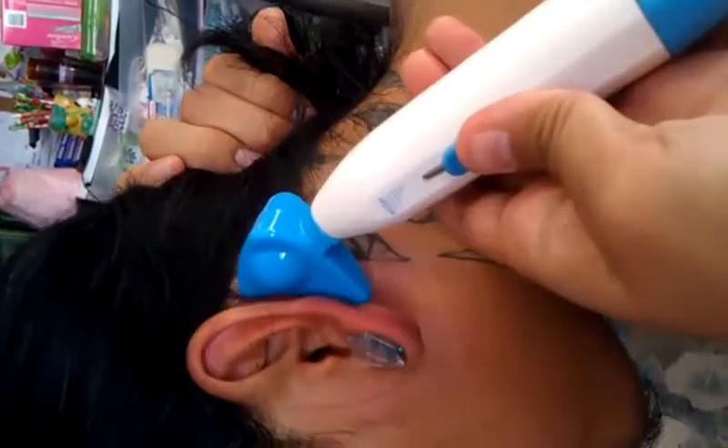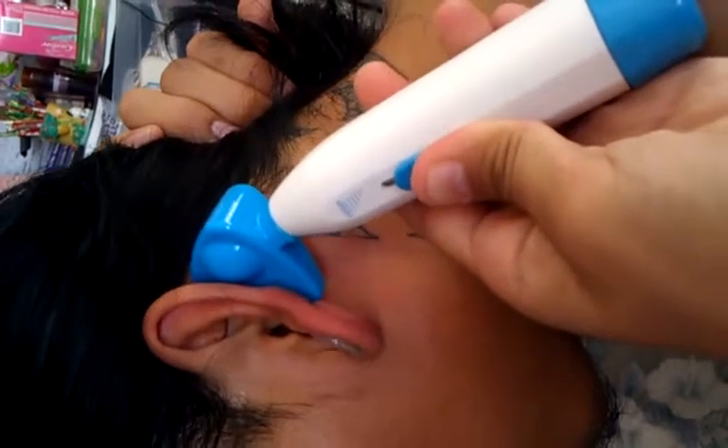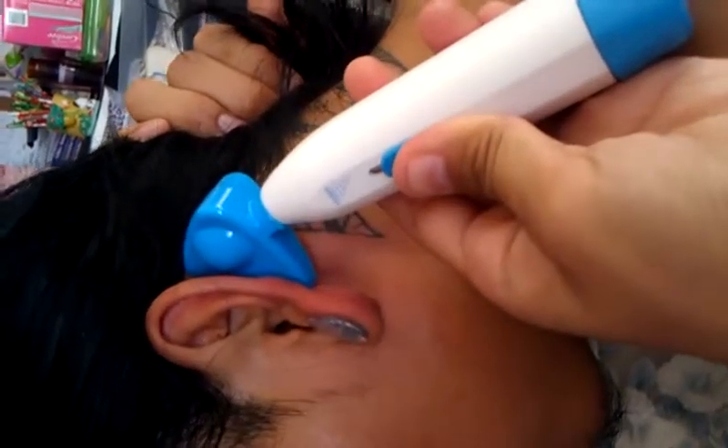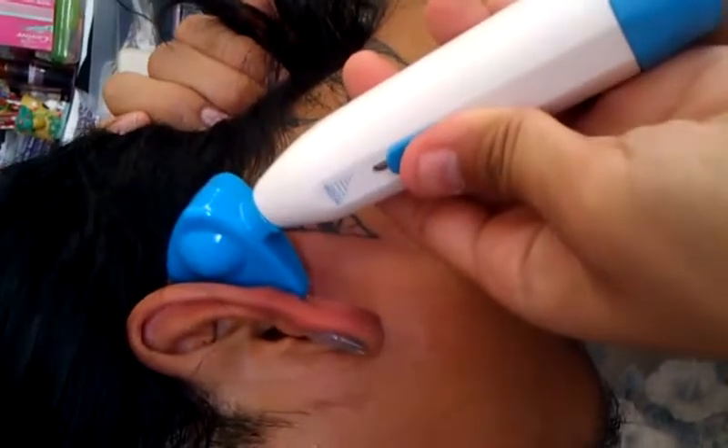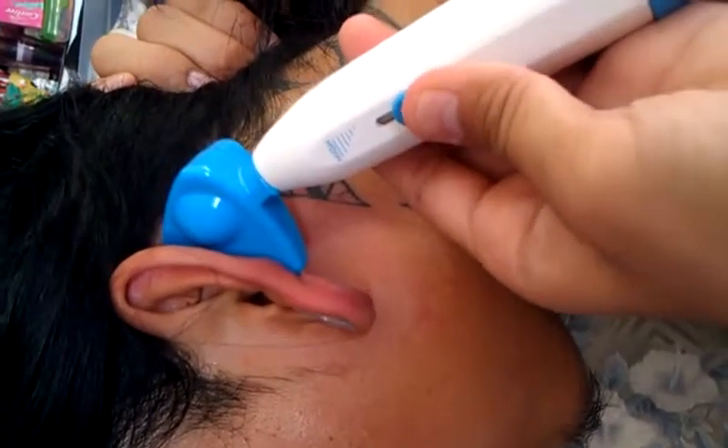This is how it works. You would put this part right here against the groove in your ear, right in here. Then you turn the lever on — that's just the sound of it hitting his earring. You would leave it there for about a minute, and then you would turn it off. And that's basically how it works.